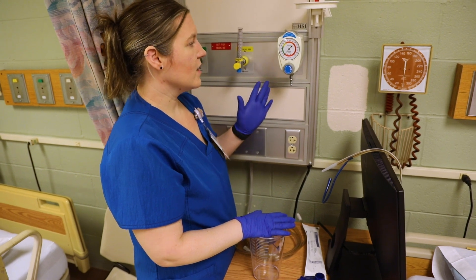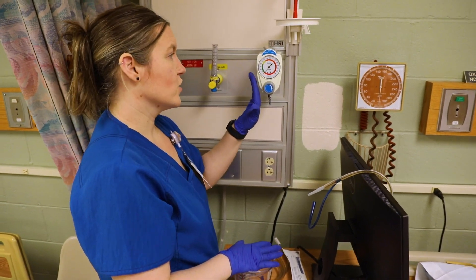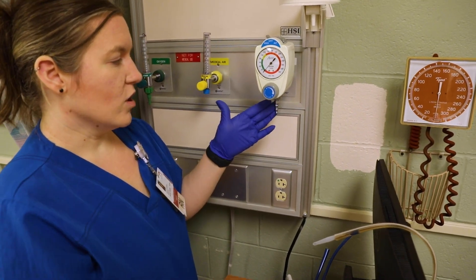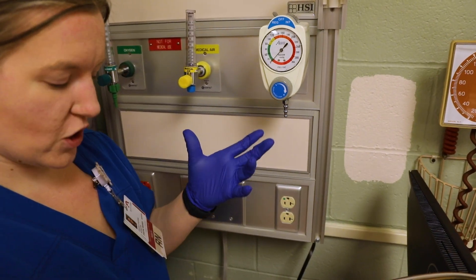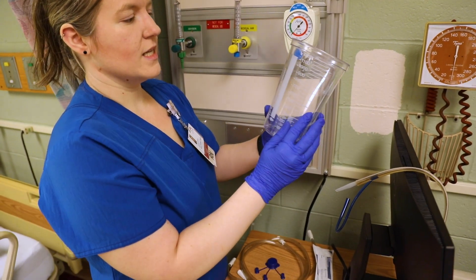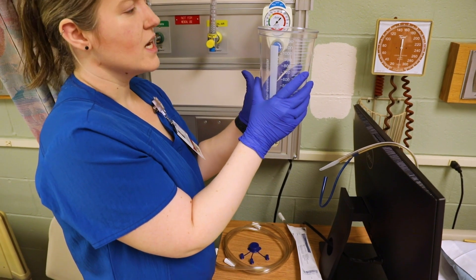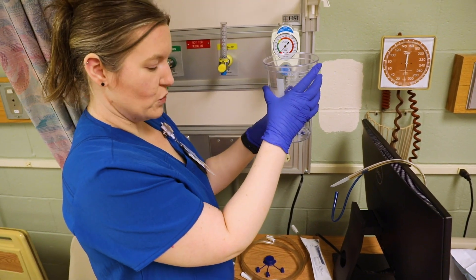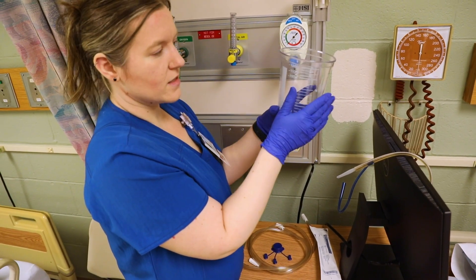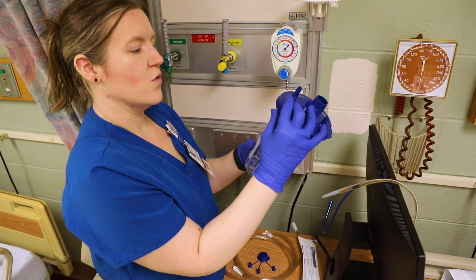I'm going to show you how to hook up suction. Some of these vacuum containers are a little bit different, so make sure you have the correct one — some have additional connectors. This is just what we have here in our lab. What you want is a canister that has a gauge. Some places have containers you keep in the patient's room with disposable inner linings. This one is just the container. You have to have your cap, so I would just push that cap on.